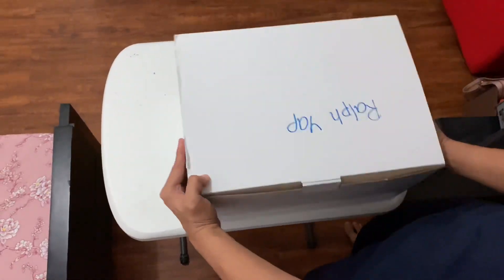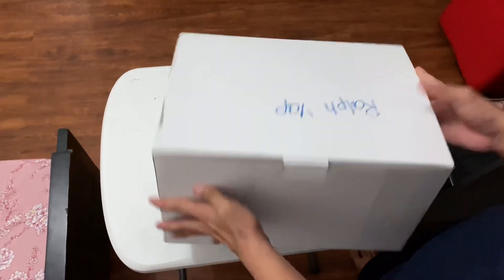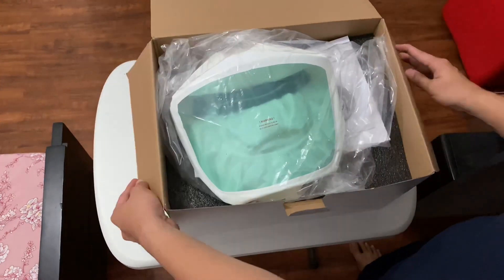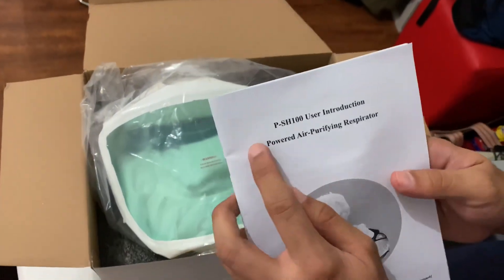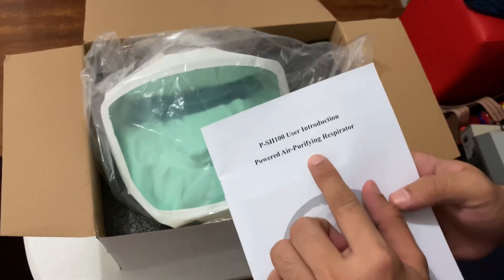Now, so this is the box. Let's open it. It has a user manual. It's a PSH-100 powered air purifying respirator.